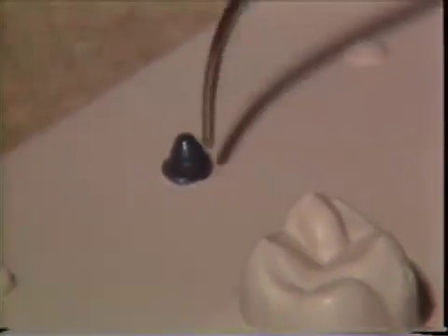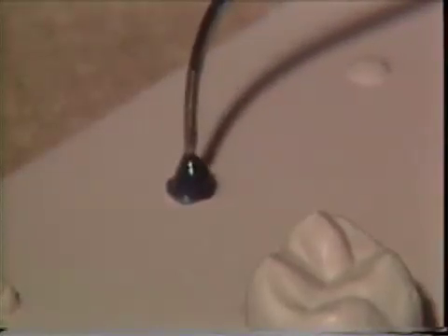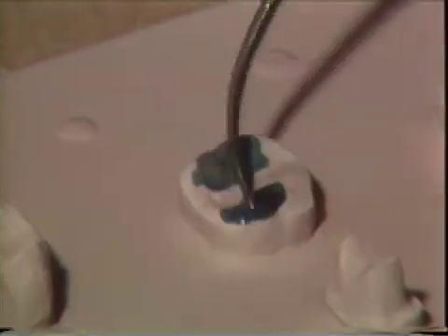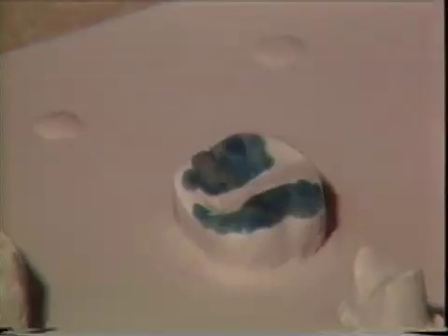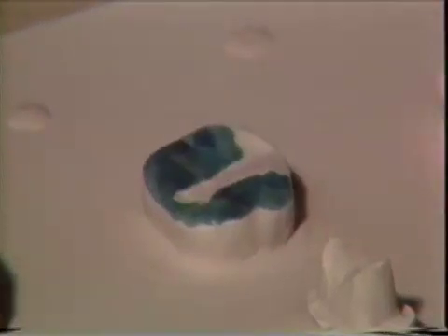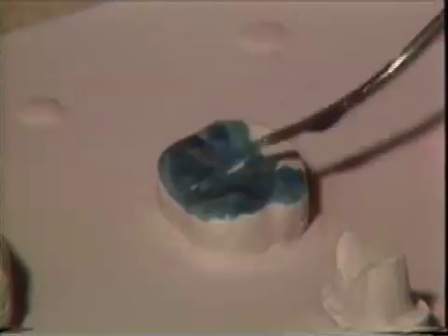If you'd like, you can warm your instrument very slightly and just smooth up the sides of that a little bit. And there's a cusp tip. To begin again, we overheat the little bit of wax and just start to flow the wax into the stone so that we have a surface we can adhere subsequent additions to. The margins of the reduction are quite clear so you know exactly where the original axial surface ends. We don't want you flowing a lot of wax beyond that point — try to keep the wax contained in the work area.